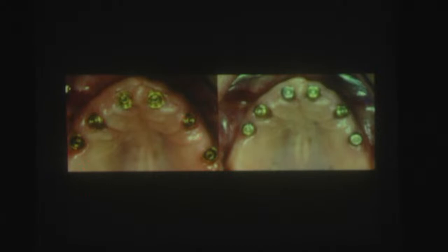Placing the implants and multi-unit abutments on top, okay? Once we put the multi-unit abutments and if we observe that the multi-unit abutment is fully seated, please torque it with 30 Newton and don't touch it again. If you don't touch it, you will find a very, very beautiful gingiva with keratinized surrounding tissue, and you will like it. This is what we call the one abutment concept.